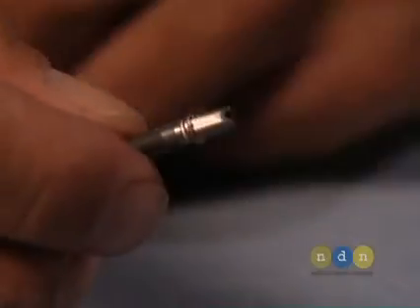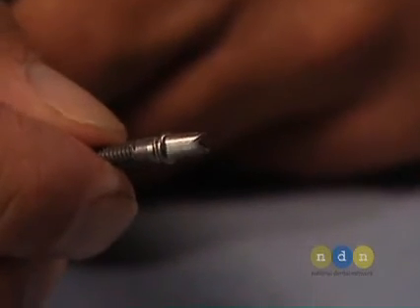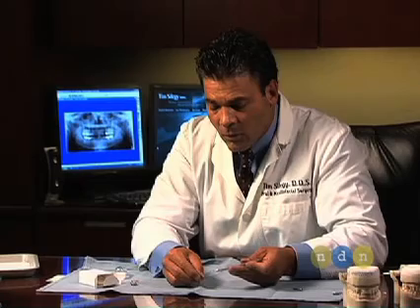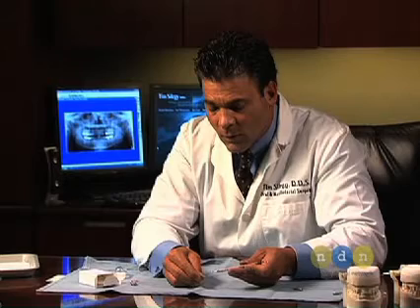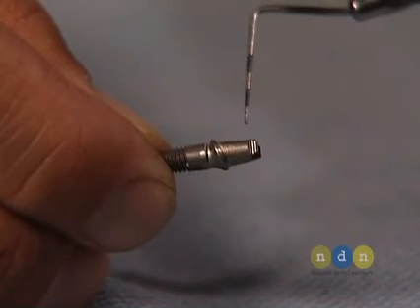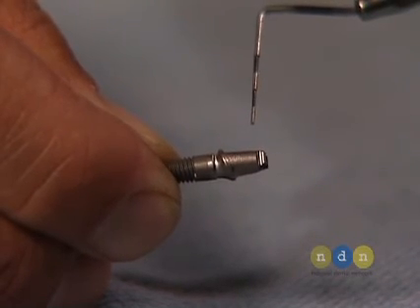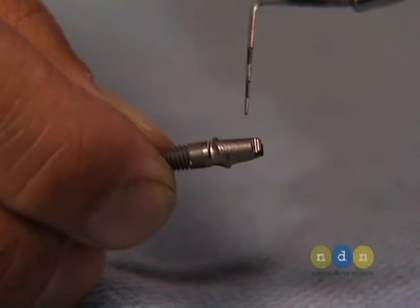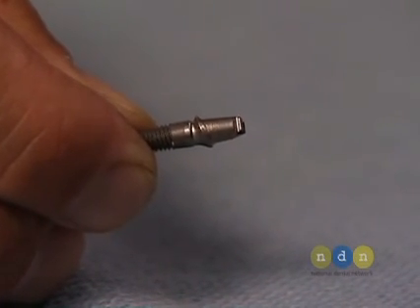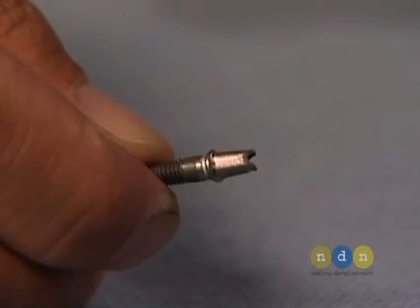The coronal portion of the Zimmer one-piece implant is designed based upon the HexLock Contour Abutment. The most coronal portion of the one-piece implant has a characteristic notch shared with the HexLock Contour Abutment, which means the same impression kits used for the HexLock Contour Abutment can also be used for the Zimmer one-piece implant.